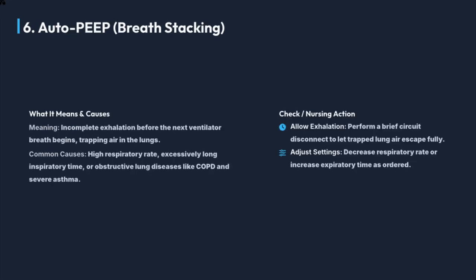Auto-PEEP or breath stacking occurs when exhalation is incomplete. This is common in obstructive lung diseases. To manage, briefly disconnect the circuit to let trapped air escape and adjust ventilator settings.